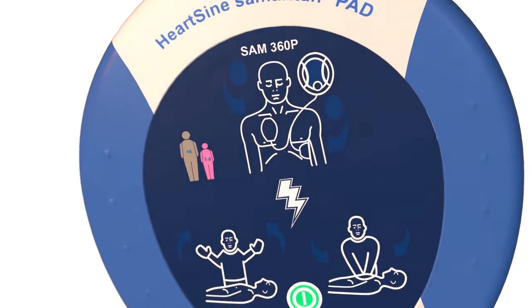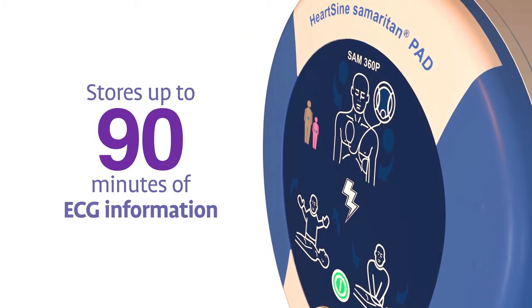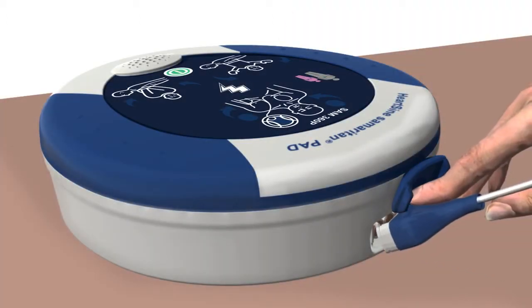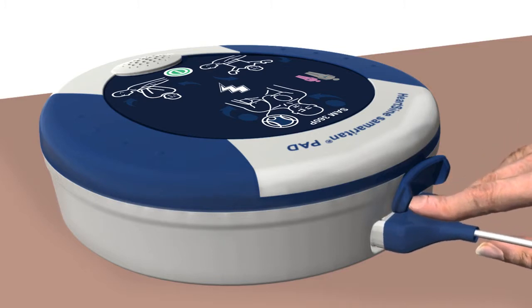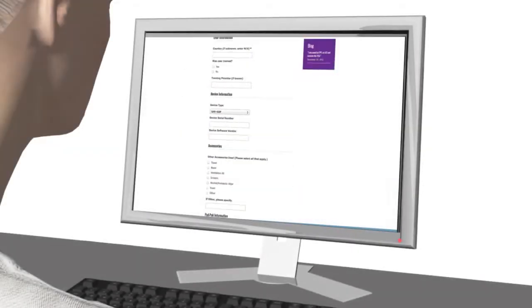The Samaritan PAD stores up to 90 minutes of ECG information after use. Use the Saver Evo software, which can be downloaded from the Heartsine website, and the custom USB data cable to download the event data for a physician who may want the information from the device to help inform treatment decisions.